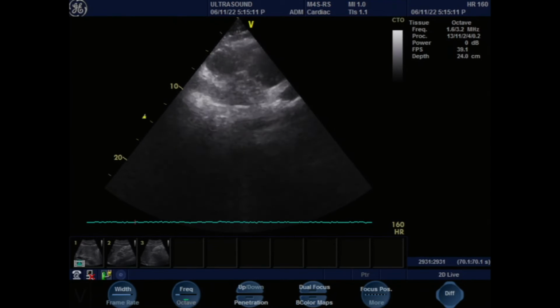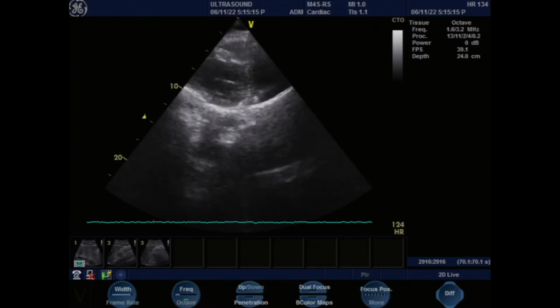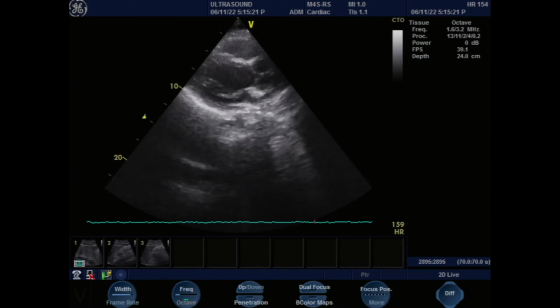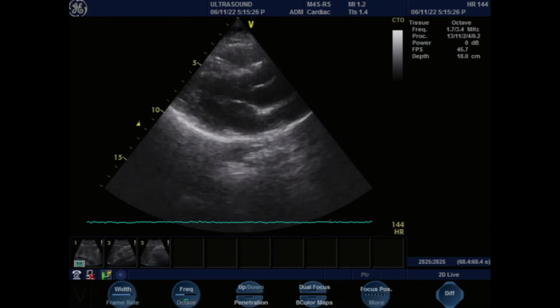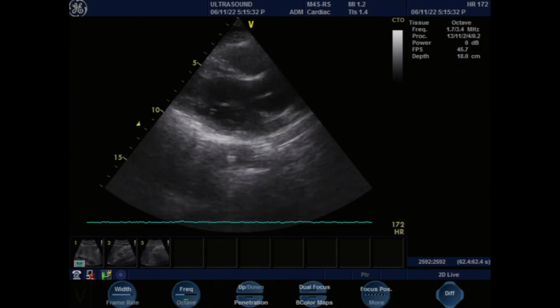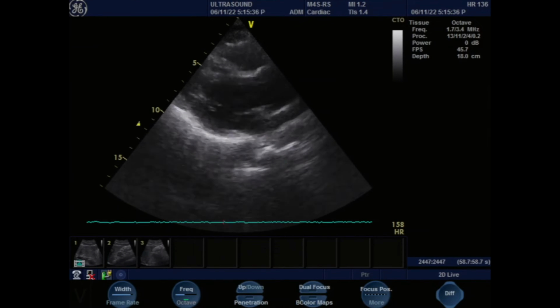For the transthoracic, because the mitral valve sits in the back of the heart. Yeah, so you're right there. So you got the parasternal long axis view that we learned about. Okay, let me increase. Just stay right there. Okay, now this gives you an idea of, again, this is your aorta, the aortic valve, the mitral valve. The left atrium is pushed a little bit, and then here's the right ventricle. The right atrium does not exist in this image.